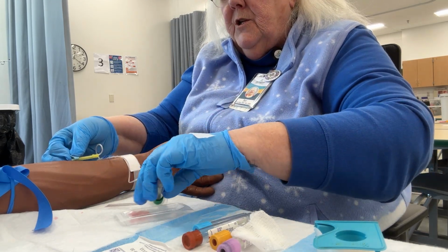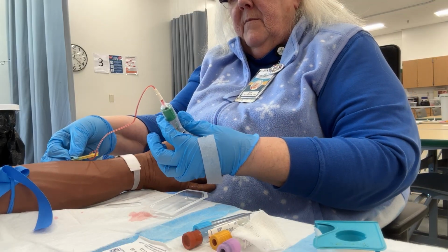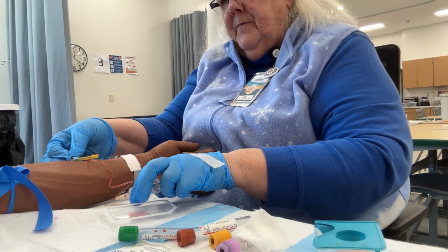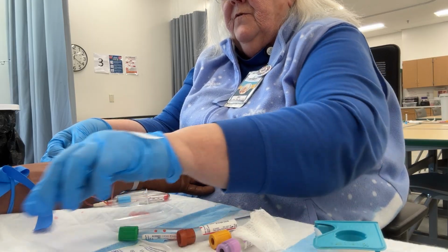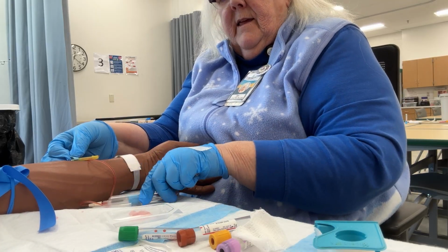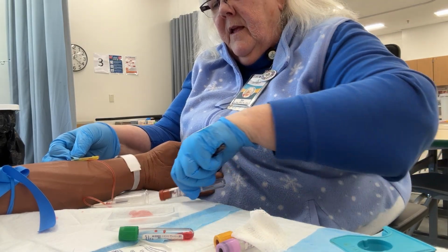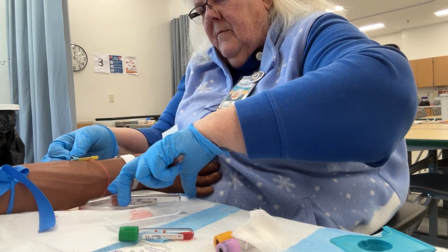Pick up my first tube, which is to just get some blood coming through so that I can draw a blue top tube. Now I'm going to put my blue top tube on. And with a blue top, you want to make sure that you fully draw it, that you don't leave any air or anything like that. Okay? So here's my blue top tube. And I rotate it, stick on my next tube, which in this particular case is a red top.